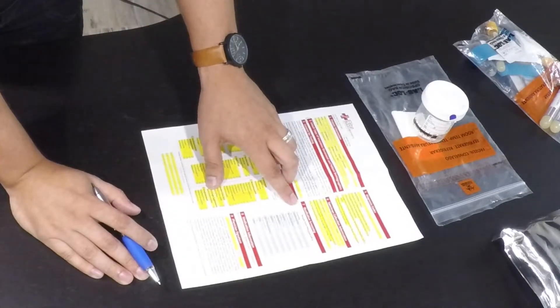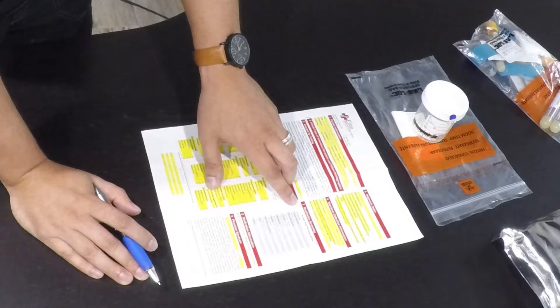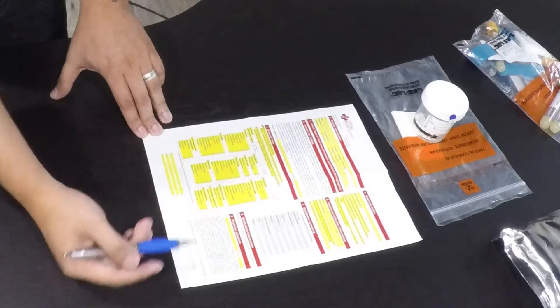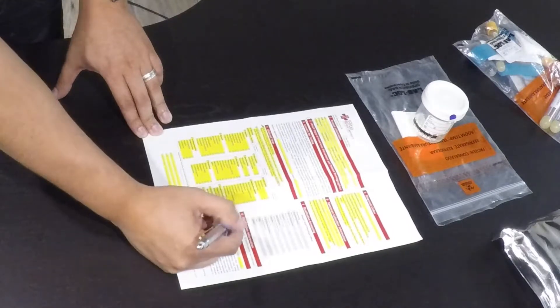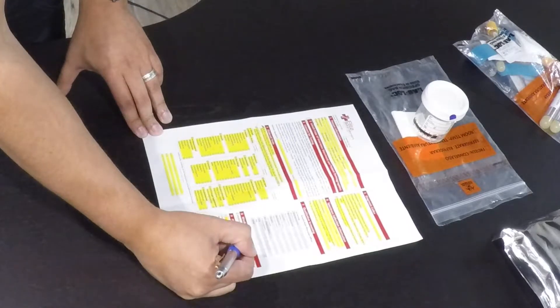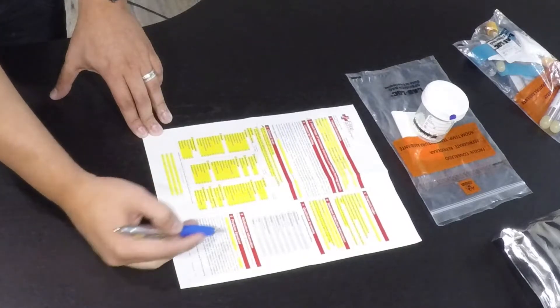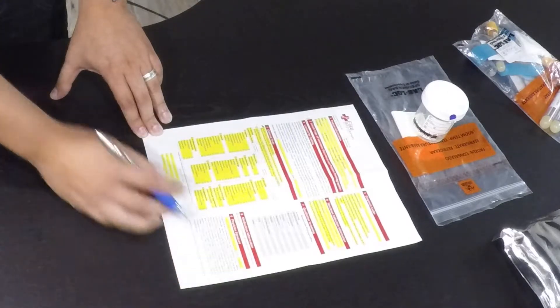Field number seven is only applicable if the clinic is doing point-of-care testing. Field number eight is medication information — the MA will check off either 'medication list attached,' 'medication reports,' or 'no medications.' Field number nine requires the physician's signature and date of collection.